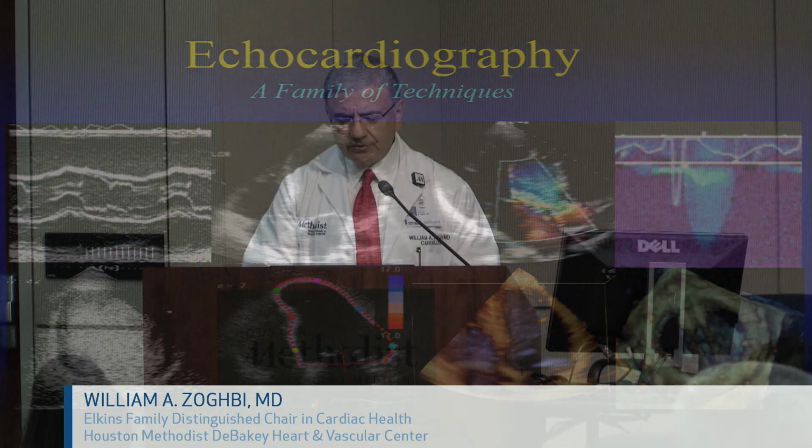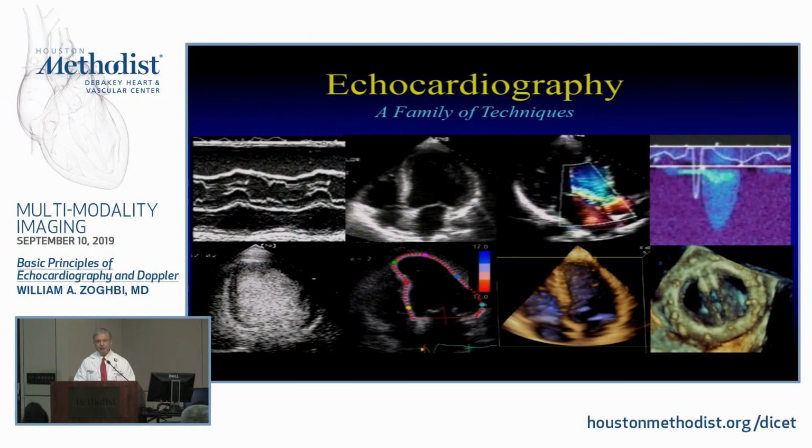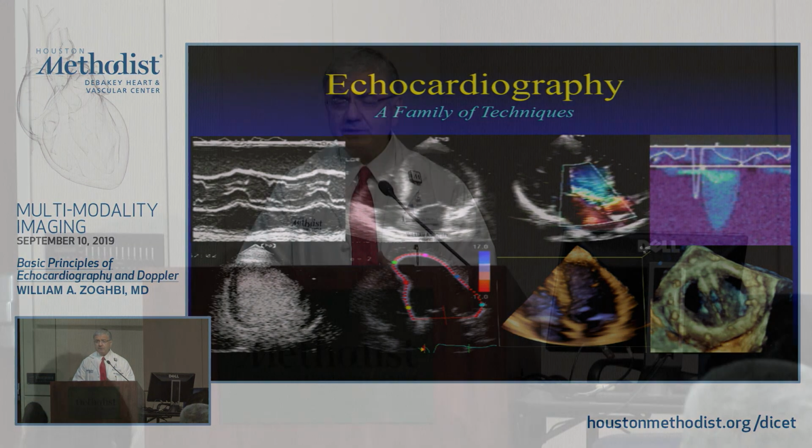I don't have to tell you, if you've been in this field for some time, how much progress we have had throughout the years. And the amazing thing nowadays is you could see with ultrasound, without any harmful energy, the heart and its structures in real time.